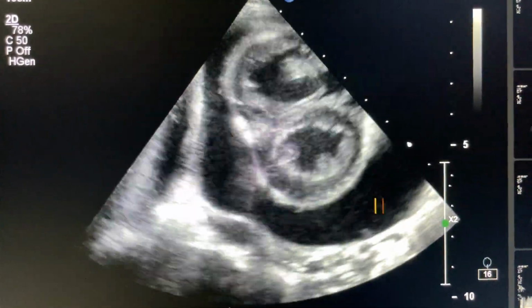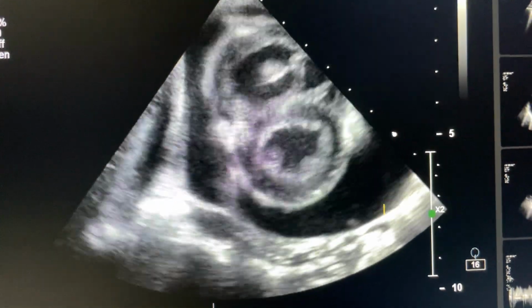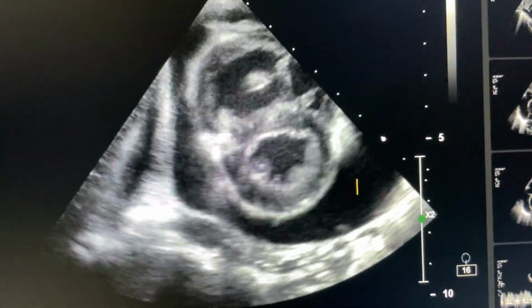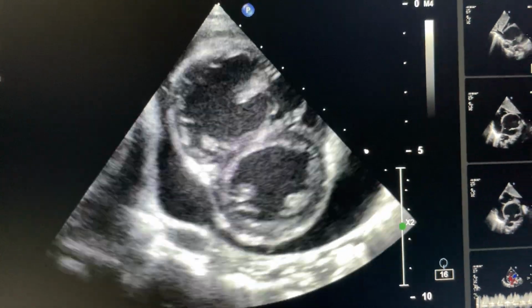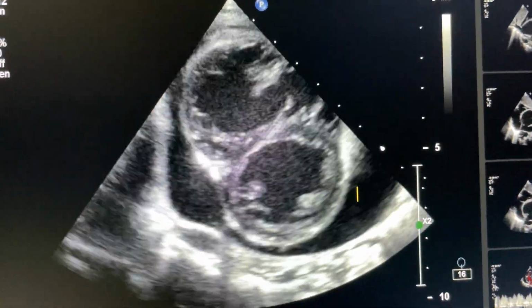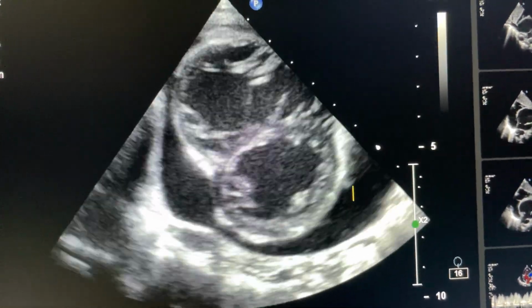Effusion is more in this portion. Why does this portion have more effusion? Because of gravitation. The most dependent part will have more pericardial effusion because free fluid is present in pericardial space.